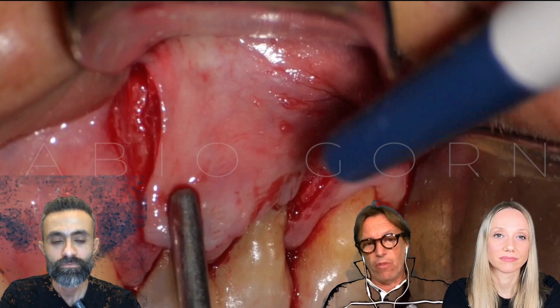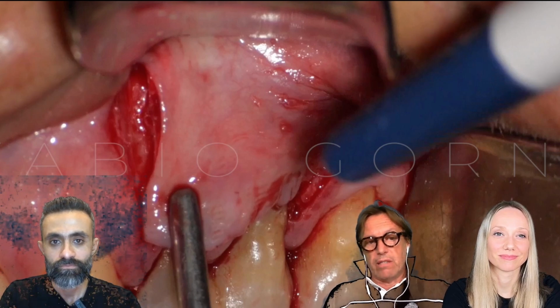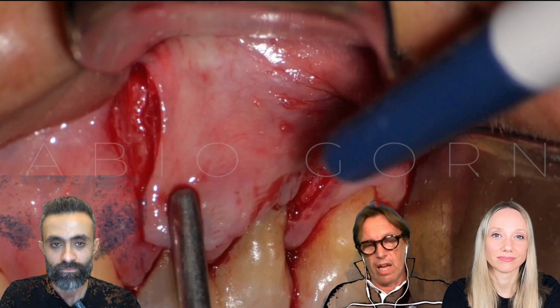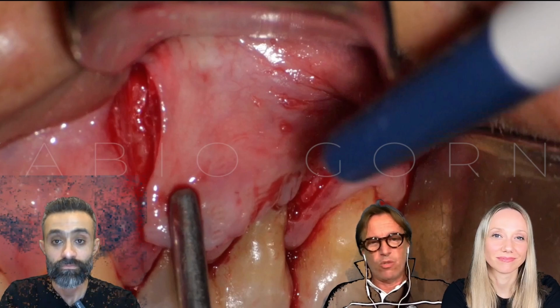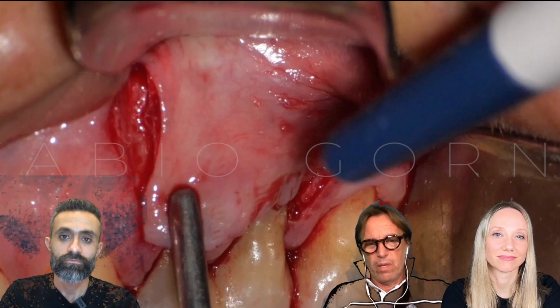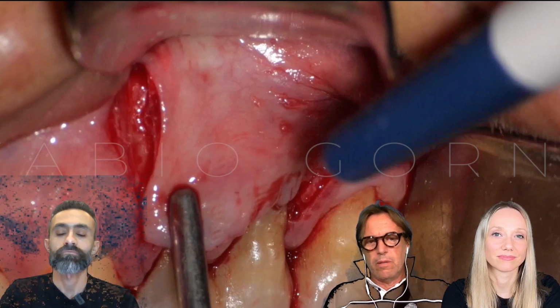It's a big problem, but I want just to underline one thing. A couple of guys who probably do a lot of surgery all around the world, Jean-Yves Cochet and Bertrand Cailleteau, are using IRM. That is Super EBA. It's the same material. So if you want, you can use IRM. Super EBA is a little bit harder, so I love it.